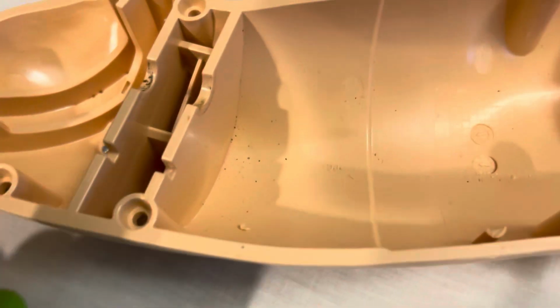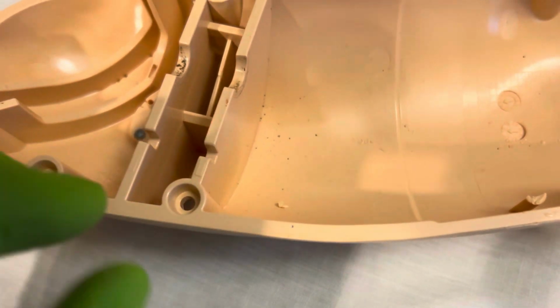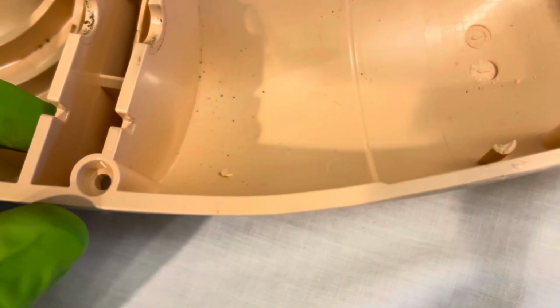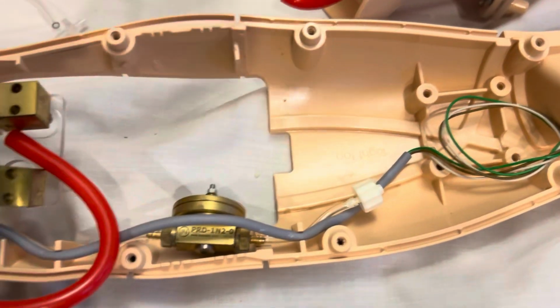One of them is because when this hose gets clamped in here and you get a lot of volume through there, especially on an IV pump, it can expand the hose and break it down over time. So I like to actually hone out this area and send it through a different spot, which we're going to do in a second here, before I get to the exit port, and then remove it from any of these clamping areas, because again, the hose expands, so it does damage to it within those tight areas. So, all right, let's get going on this.